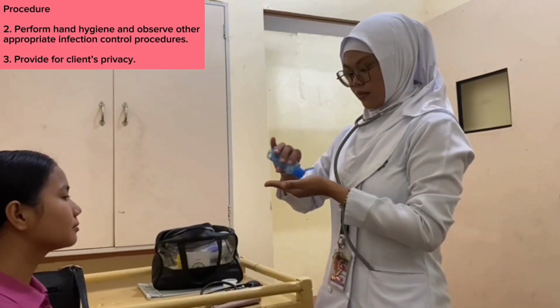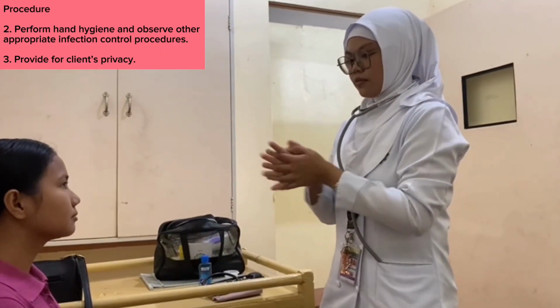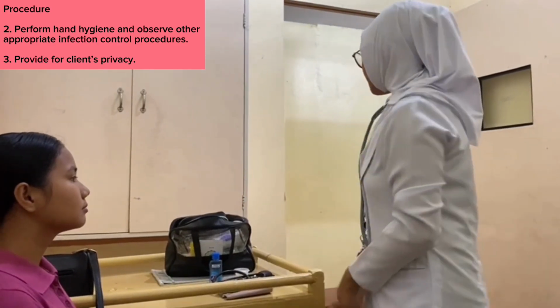Second, perform hand hygiene and observe other appropriate infection control procedures. Third, provide for client privacy.